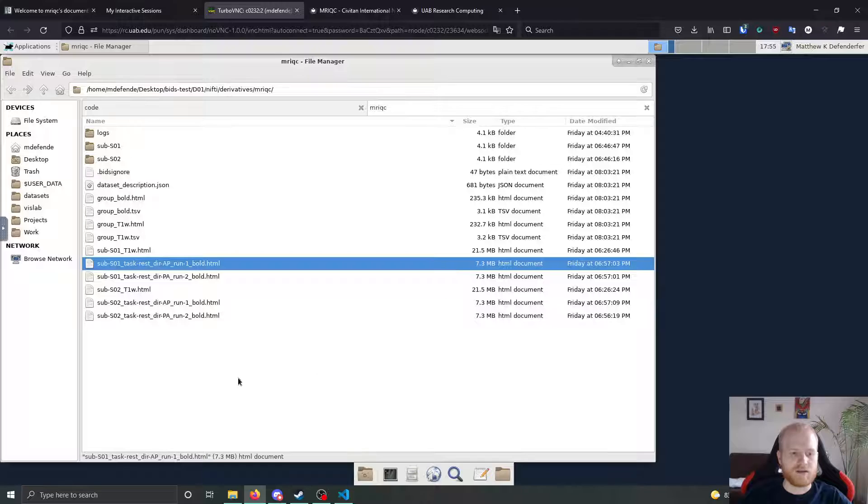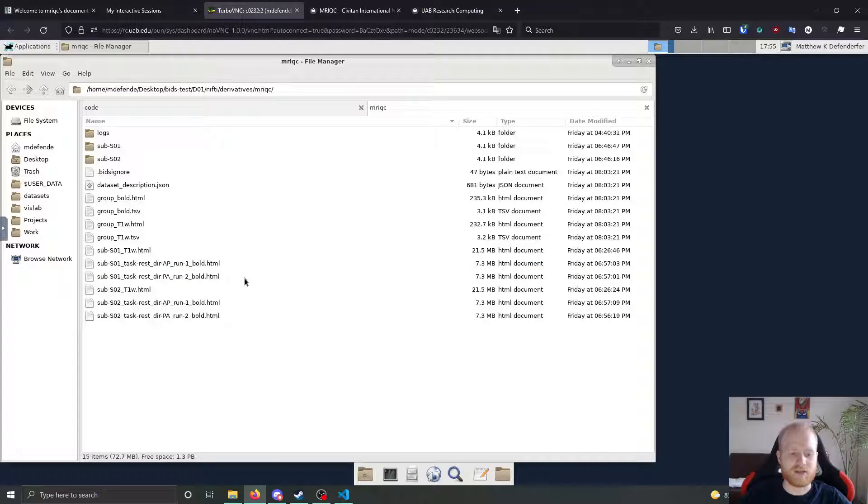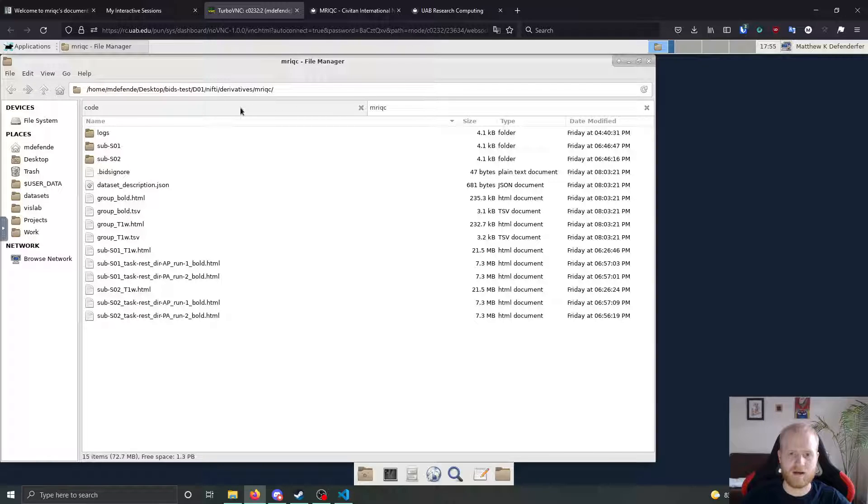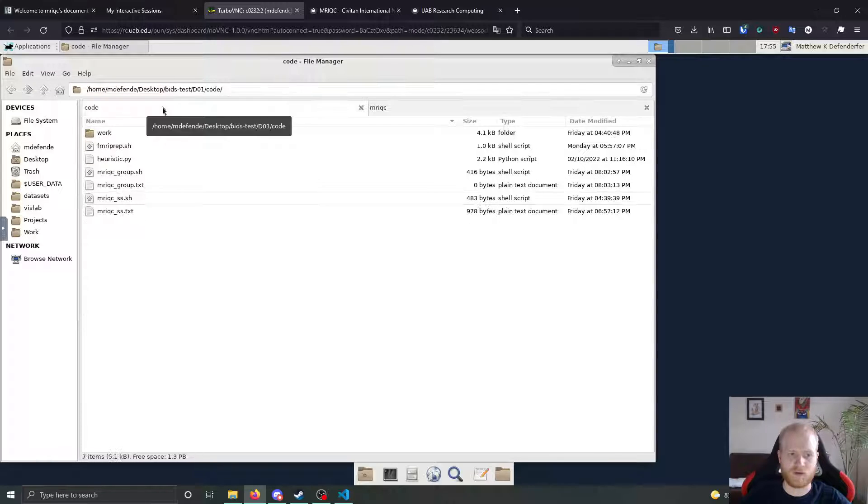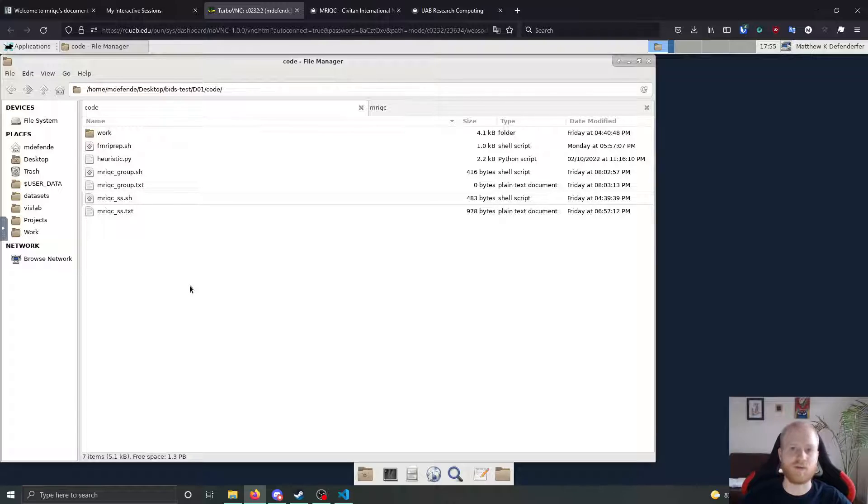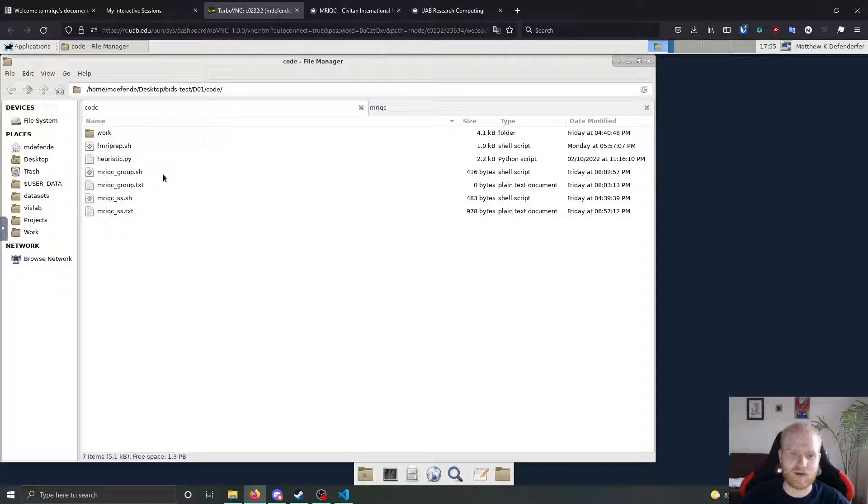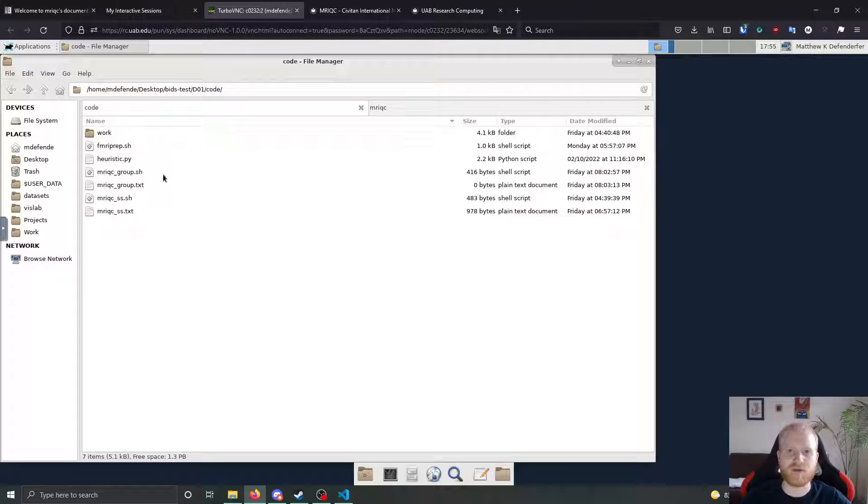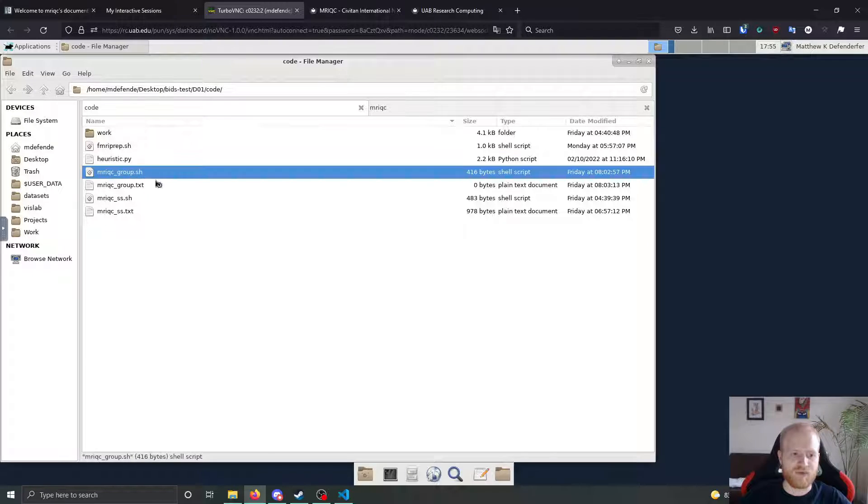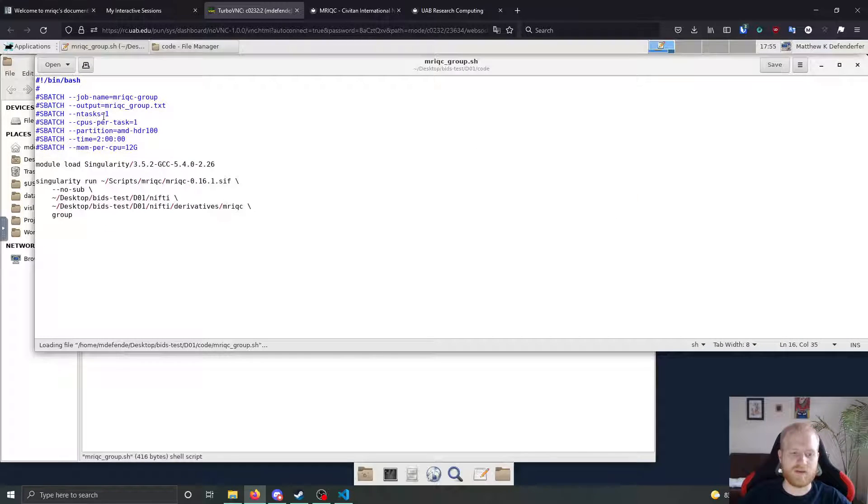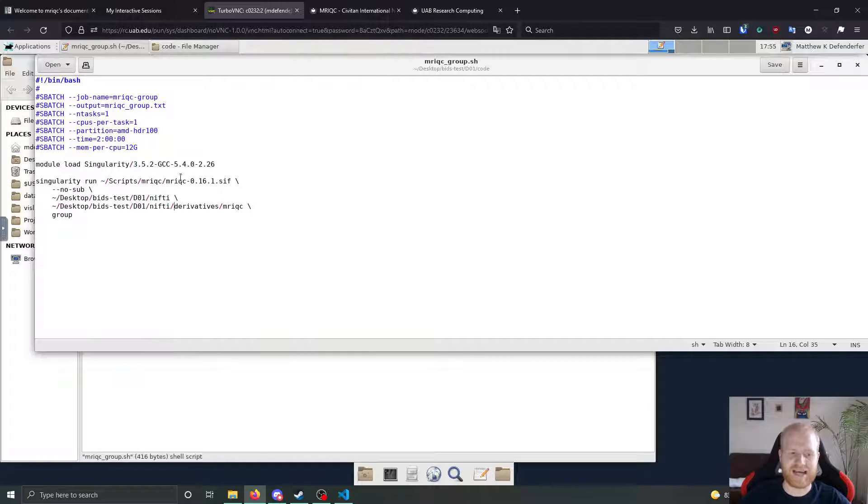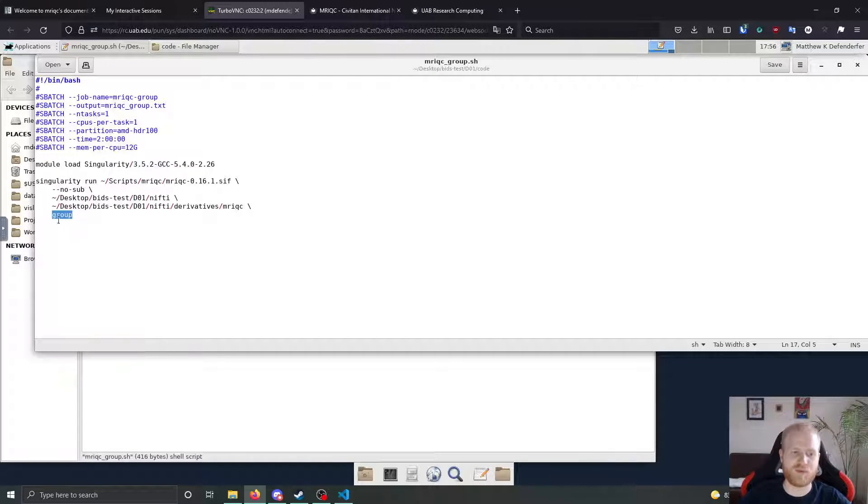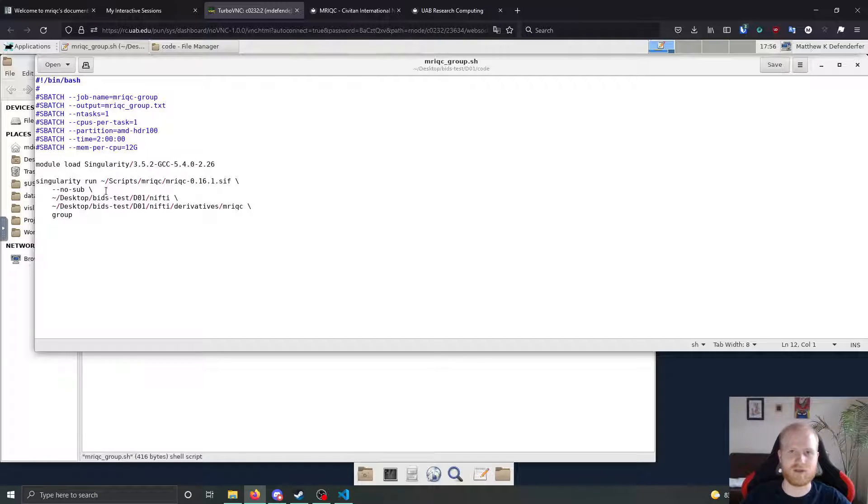So you can do the single subject outputs. You can look at those. Those give you a good idea of the quality of the scans and you should look through all of them and mark them. But you can also run a group analysis after the participant level that takes all of the individual image quality metrics and aggregates them together into single plots. So if we take a look at what the script looks like for this, it looks pretty much exactly the same, except we've switched this from participant to group and we've taken out the participant labels.